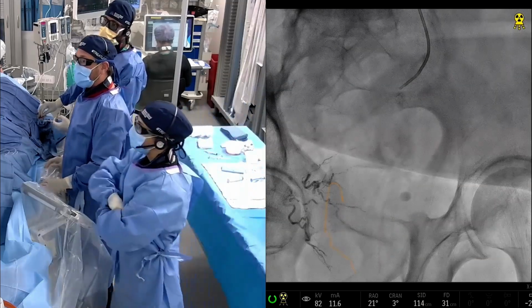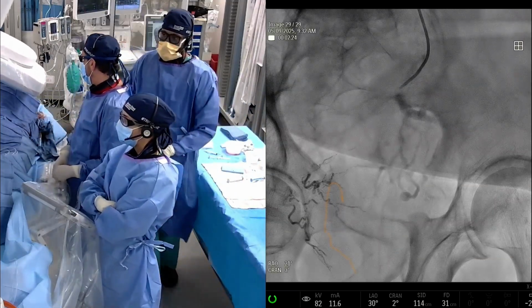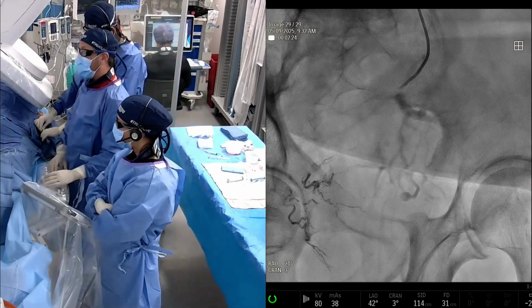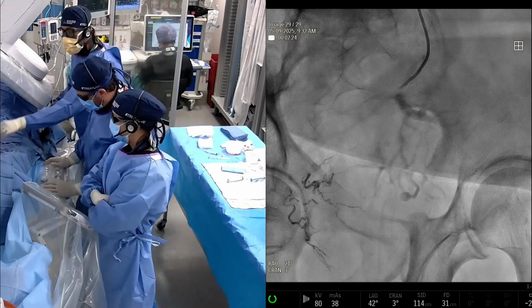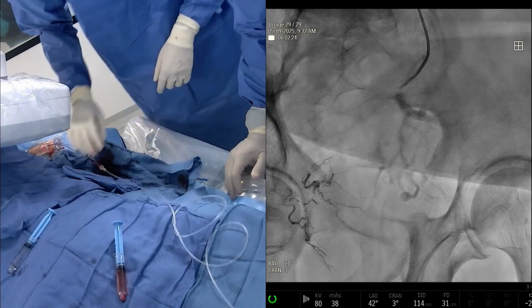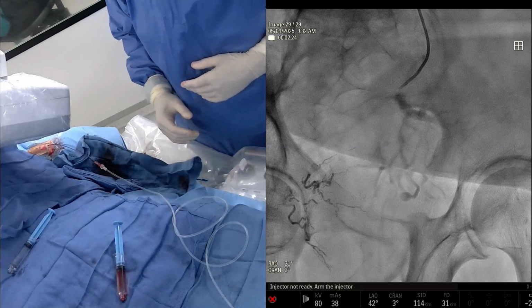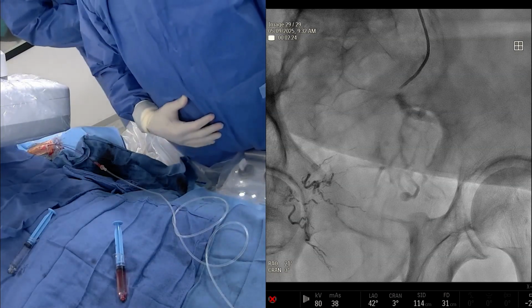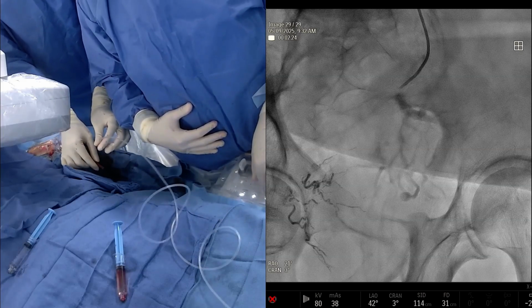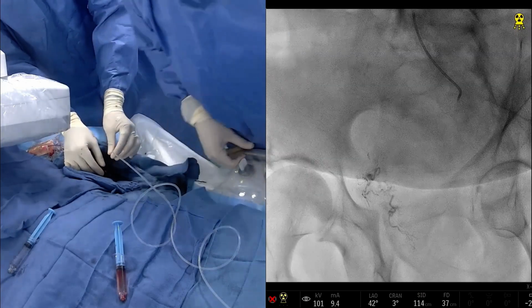I think there's lots of different anatomic landmarks that make a lot of sense, and I try to use the patterns that Dr. Carnevale came up with in terms of the types of anatomy, and then potentially where you're going to see the collaterals. We know all the common locations of collaterals, and unless you have a patient that has very severe PAD, you're going to see those patterns in almost every patient. This patient has some atherosclerotic disease, but no occlusion so far. So I don't think we're going to see any weird aberrant anatomy, but you never know.